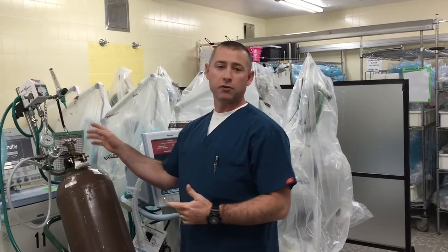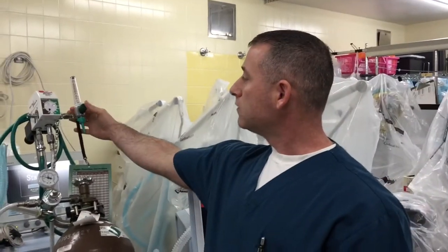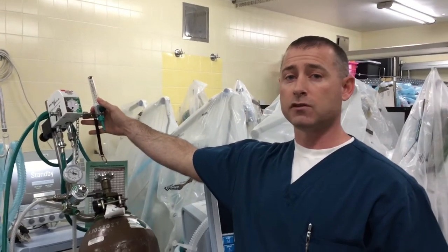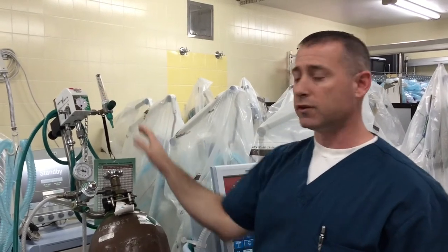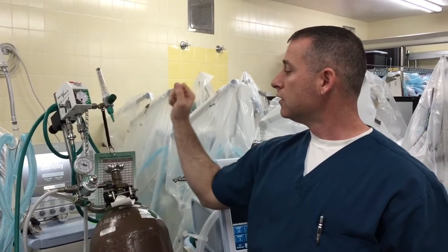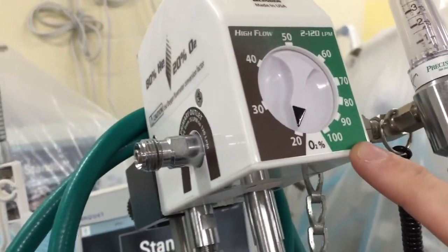We're picking up where we left off with the heliox. We talked about using the heliox with a nebula mask, which is basically a non-rebreather incorporating a nebulizer, but today we're talking about setting up the heliox with non-invasive ventilation. In this situation we're using the v60, but you can also use it with the Vision as well. I've already connected the oxygen and the heliox so we have our blender, and I'm going to leave it here at 80/20 — when it's at 20 it's 80/20 because this is an 80/20 blender.